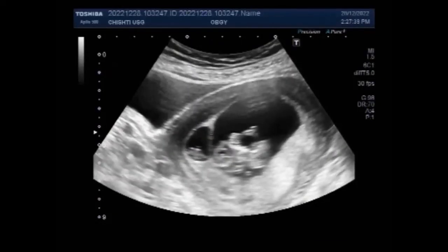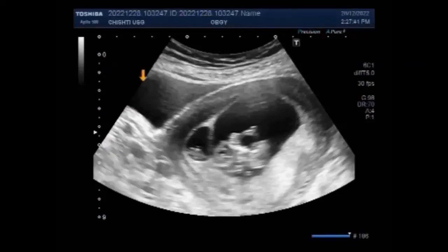You can see this is a small fetus with fetal demise.